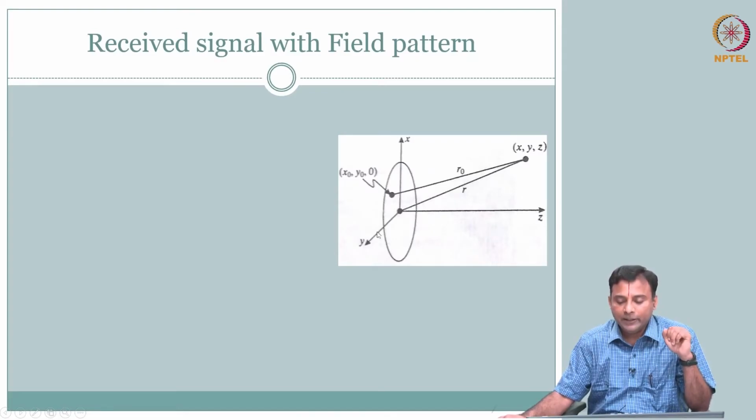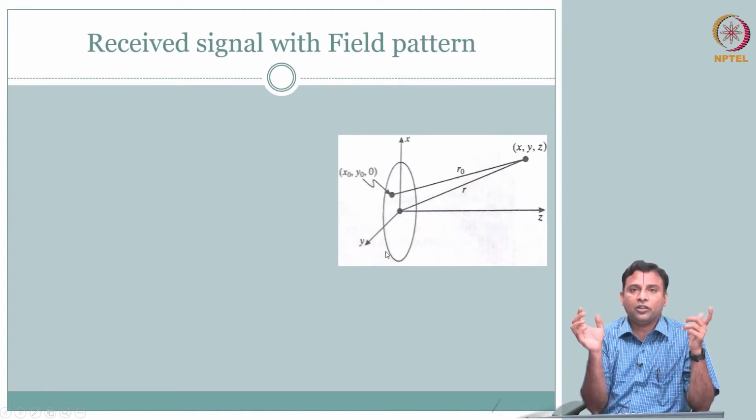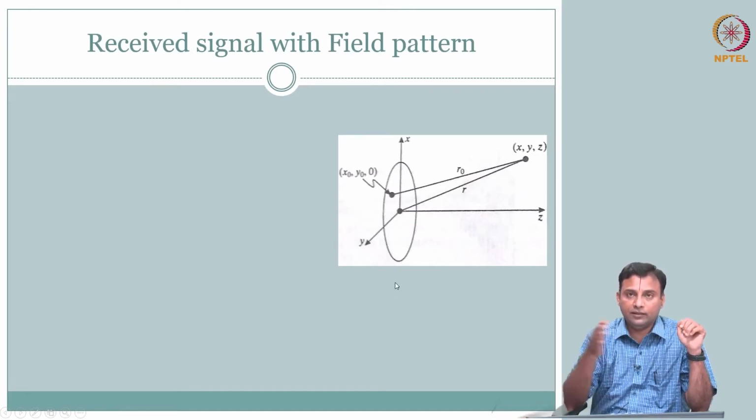Again, for simplicity, there is a circle here, but this can be any shape. Remember, the thickness mode, we are not worried about now. The thickness is going to determine your resonant frequency. That part is taken care of. So, pretend you have some thickness, so there is some fundamental resonant frequency. Now, we are interested in the shape and size of this transducer crystal.